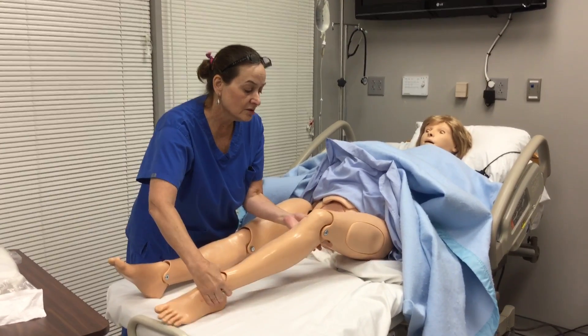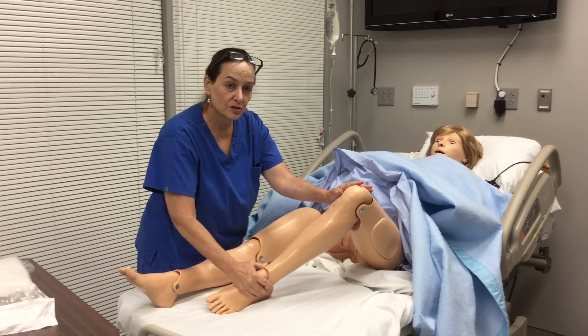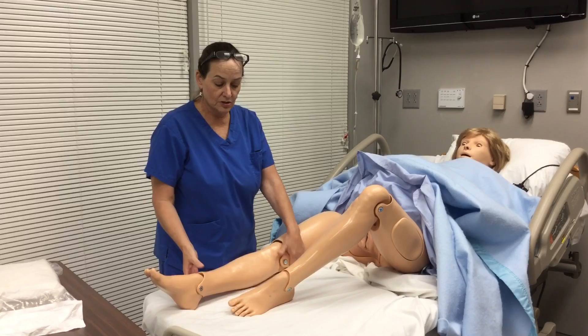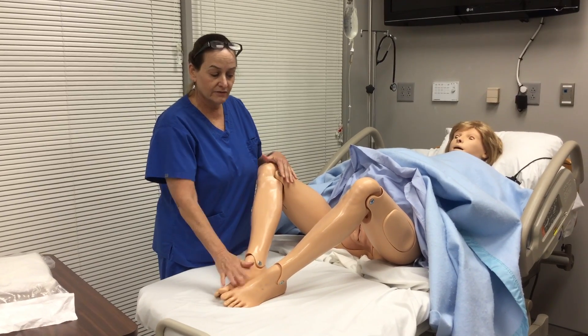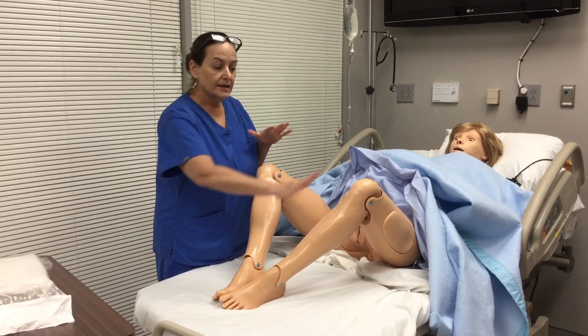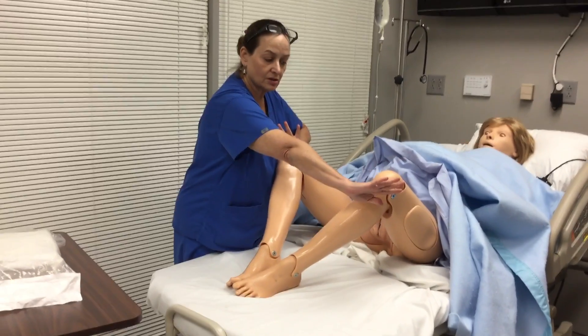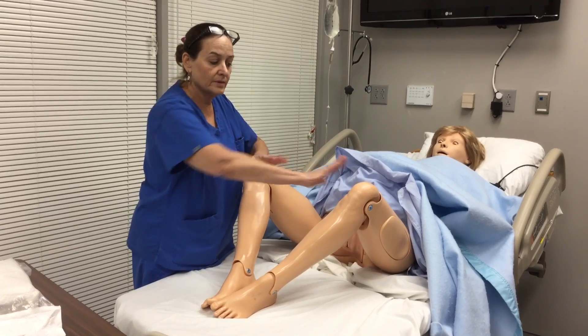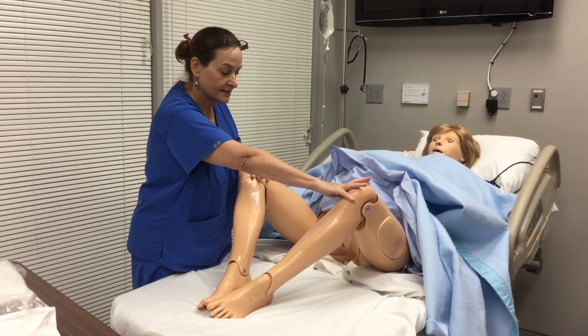You will position her legs. Remember, she can't move or feel most likely — she's going to have some limited movement due to the epidural. So you're going to position the legs so that the feet are together. In most patients, if you prop their feet together, it's going to help support them in that position, and you want them to relax their knees.